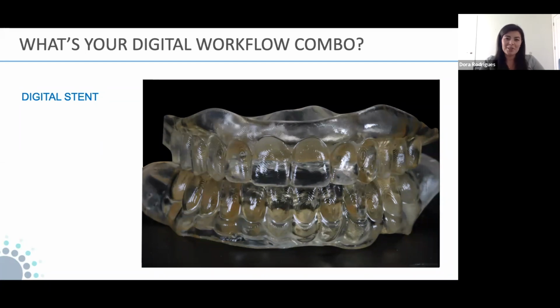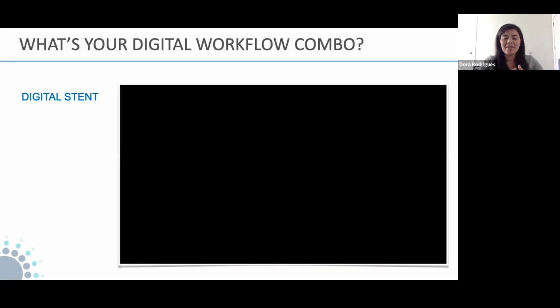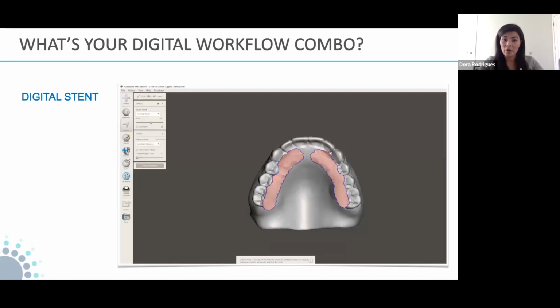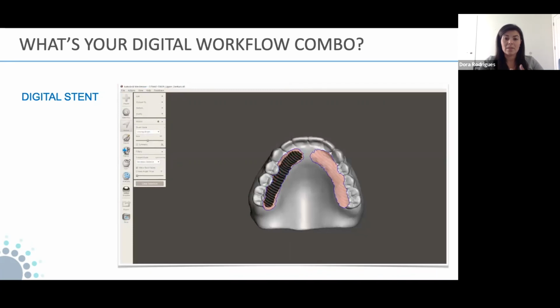So once you get into the digital workflow, if there's something you can take from this presentation, it is this: if you have an STL file from the denture that you designed, you can, in less than 5 minutes, import it to Mesh Mixer. Again, it can be very overwhelming software, but once you learn what to do for that specific step you're looking for, like this one, it is very, very simple. And I can always send you the cheat paper with all the codes later.